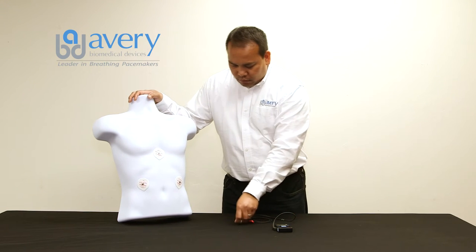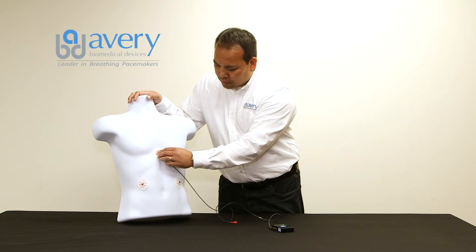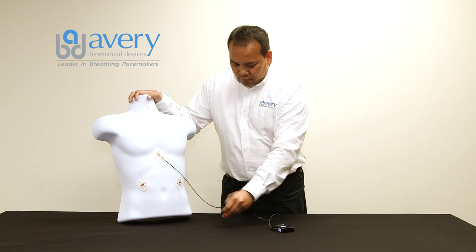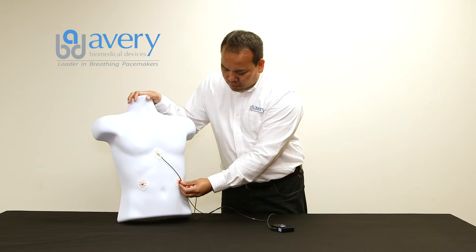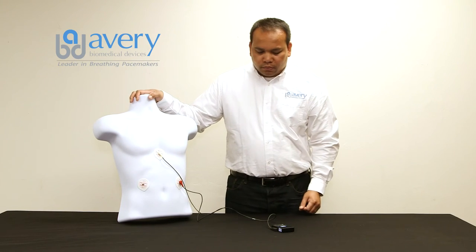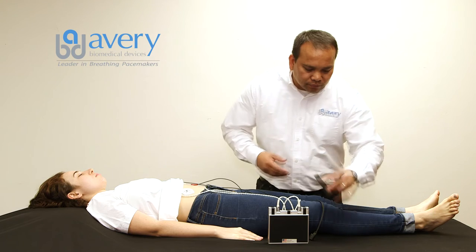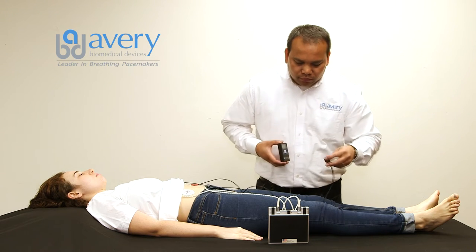Connect the TTM cable white snap button onto the skin electrode located at the middle of the breastbone. Connect the TTM cable red snap button onto the left skin electrode. As a norm, the left side is recorded first. Plug the TTM cable into the cable socket located on the side of the TTM device.